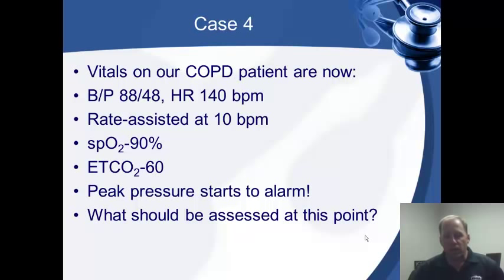Now, on these vents, whenever you get an alarm, a window is going to pop up, and it should list for you all the possible causes of that alarm. At the very bottom of that window, you should see a suggestion from the vent of what you need to do. So what do we consider if our peak pressure starts to alarm?